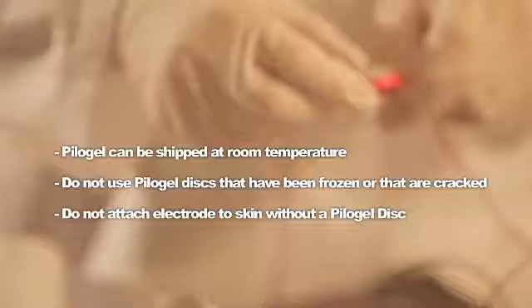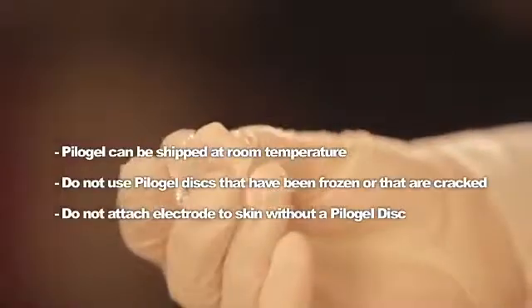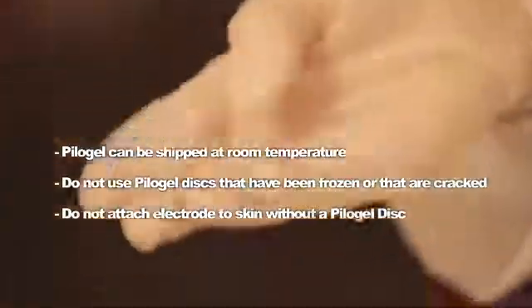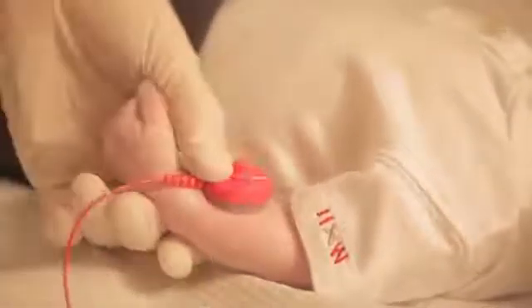Remove the pilot gel from the container. Pilot gel discs may be shipped at room temperature. Do not use pilot gel discs that have been frozen or that are cracked — discs that have been frozen will crack or crumble easily with moderate flexing. Do not attach an electrode to the skin without a pilot gel disc.